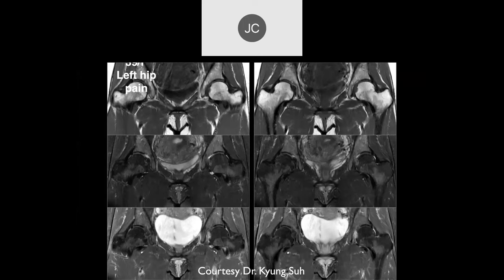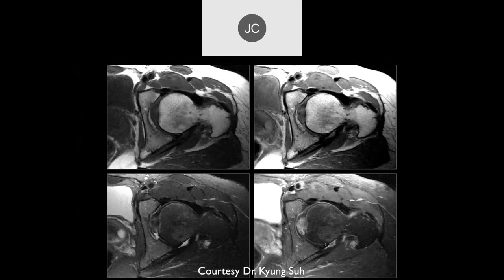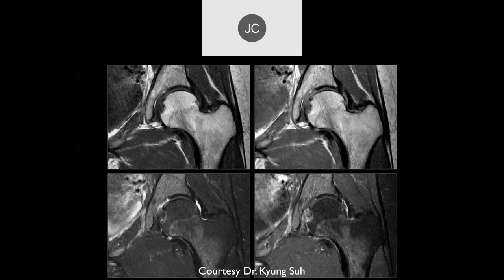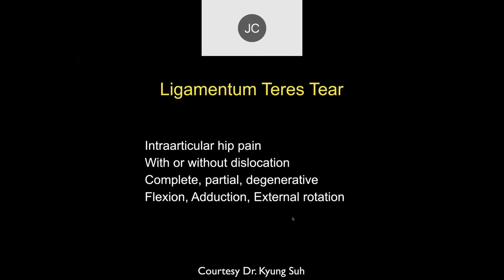39-year-old with left hip pain. On the bottom two images there's some increased signal in the ligamentum teres on the left — concerned about partial tear or sprain. On axial images we can see the same edema, thickening with edema in the ligamentum teres. You certainly have to look for injuries of the transverse ligament, capsule, and labrum as well, but sometimes it can be just a ligamentum teres injury.